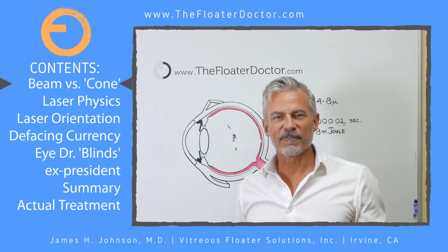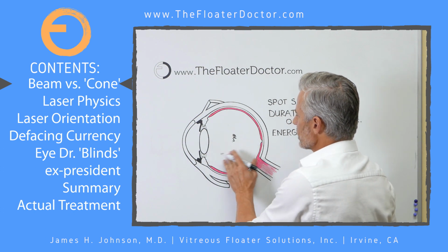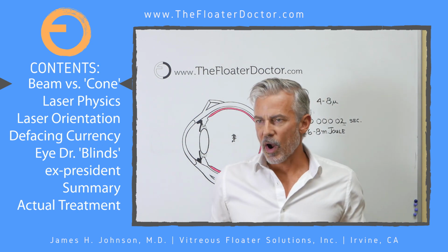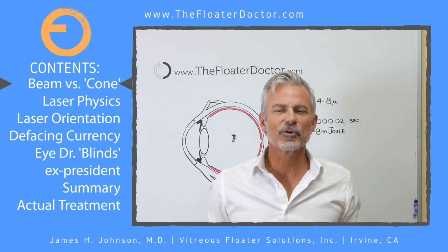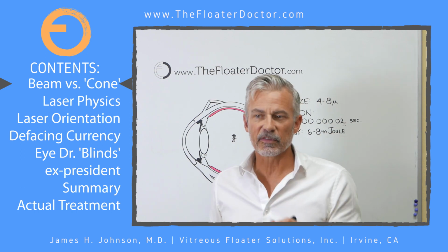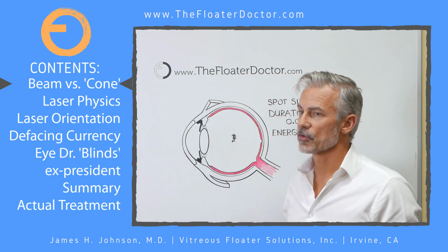So let's talk a little bit about the physics of the YAG laser when it's used for eye floaters. What we have here is a cross-section of an eye. I just scribbled a little something in there. We'll say that's our floater in this vitreous space here. Now, most of us would probably think of a laser as something that you have the cat chase around the room, Star Wars space lasers, military lasers, those types of things. And those are single beams of light that if you strike the target, great. If you miss the target, it goes on and continues on, and in this case would potentially injure the retina.